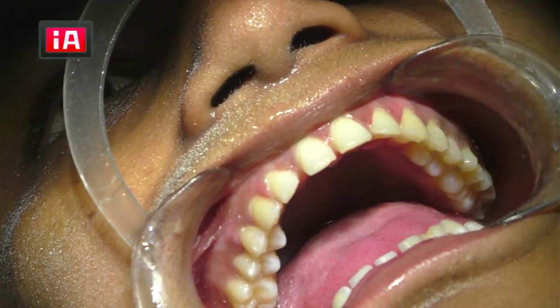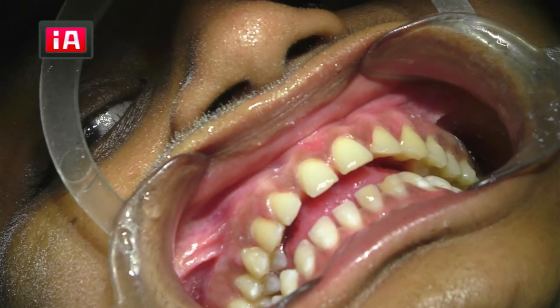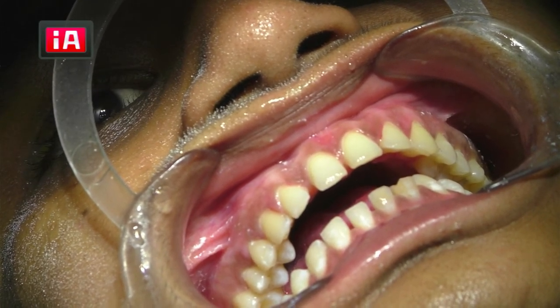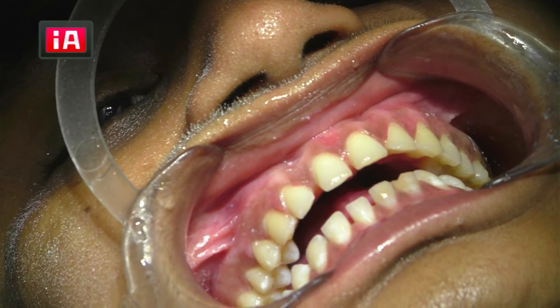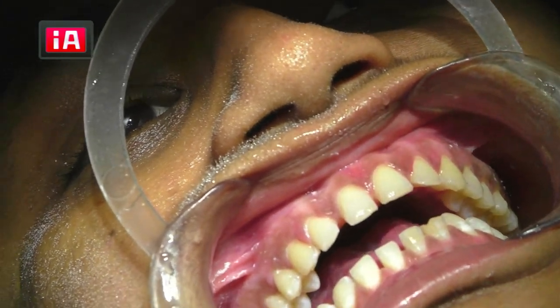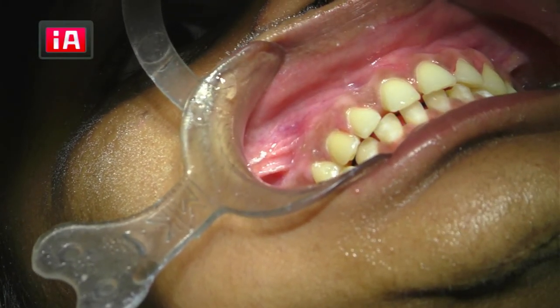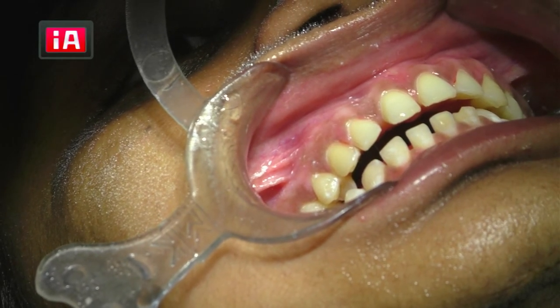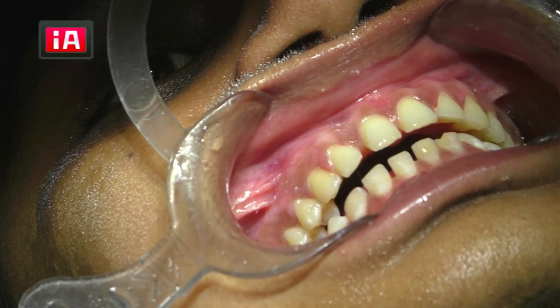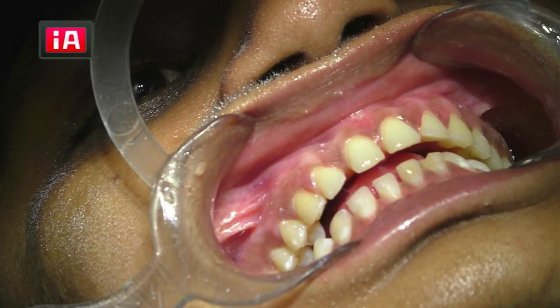Now I'll use the finishing bur, the yellow band bur. Before finishing, you can use your micromotor with the bur, so that water won't be there and you can finish very nicely. The micromotor can be connected. Use the same bur in a micromotor, not an air rotor.